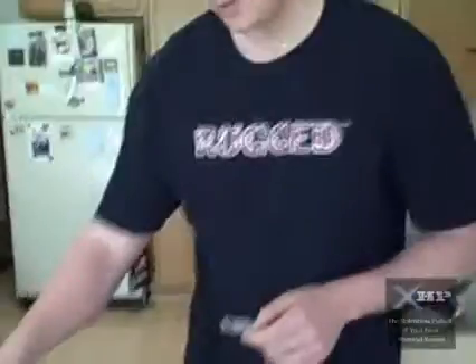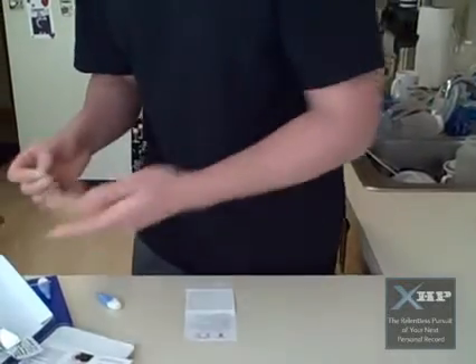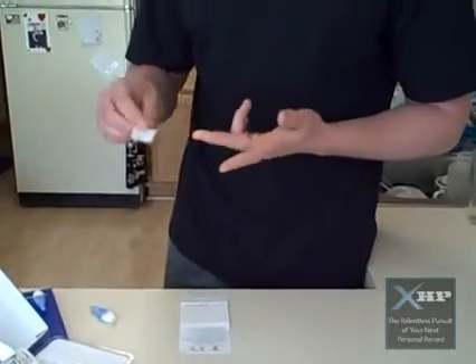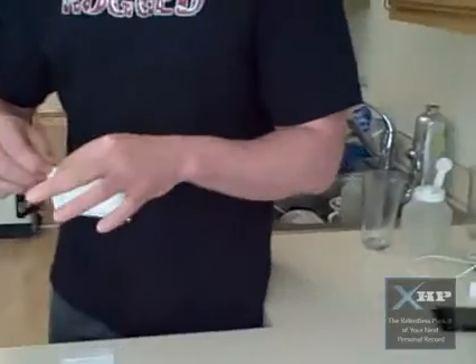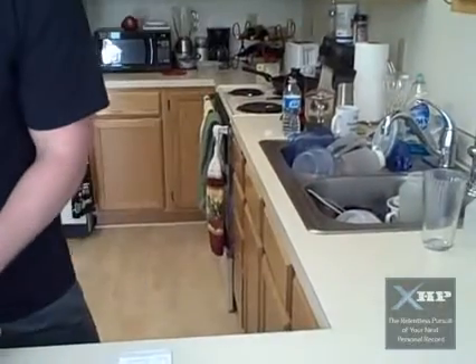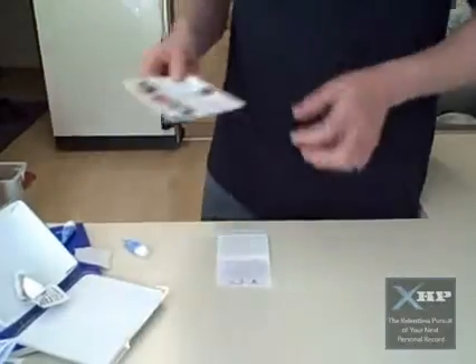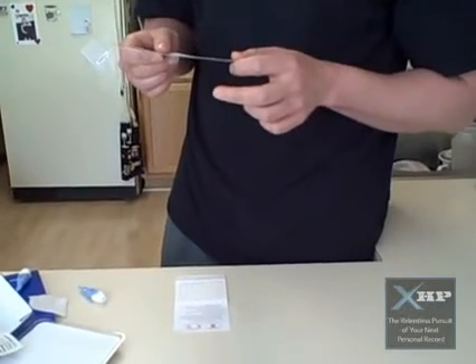Here we have my brave husband about to do his vitamin D test, to be pricked on the finger by a little vampire-ish type of majigger. So, sterile pad here. I don't think I could ever be one of those phlebotomists — people that actually collect your blood and stuff. I already washed and dried my hands, and I'll wipe the fingertip to be used with the alcohol pad.